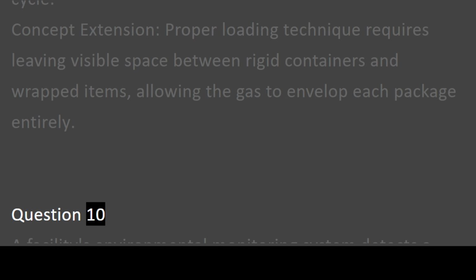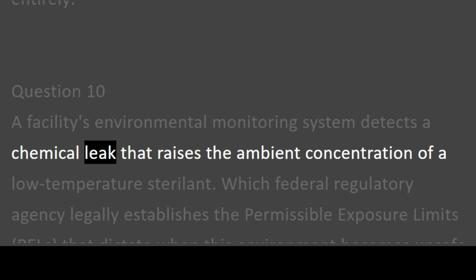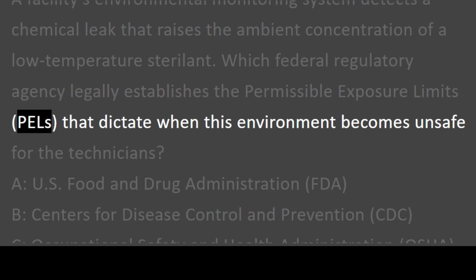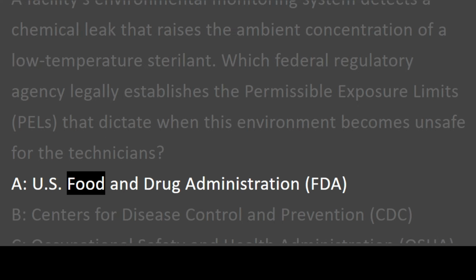Question 10. A facility's environmental monitoring system detects a chemical leak that raises the ambient concentration of a low-temperature sterilant. Which federal regulatory agency legally establishes the permissible exposure limits, PELs, that dictate when this environment becomes unsafe for the technicians? A. U.S. Food and Drug Administration, FDA.